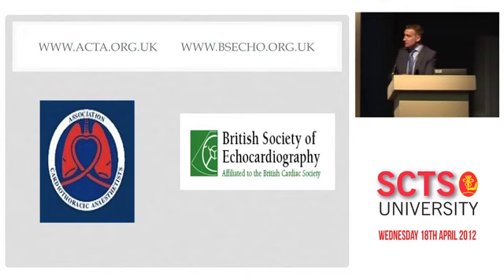Okay, that's me done to time. Thank you. I think my 3 take-home messages from this would be, first of all, if you have a myxoma, look very carefully around the septum and do that cardiological trick of going from 0 to 180 around the septum. And also expect complications of the septum and potentially with valves with myxoma.